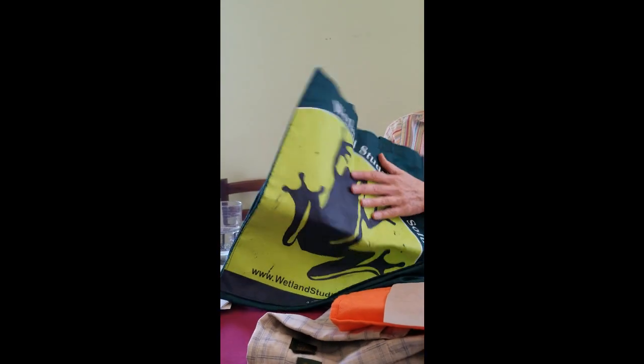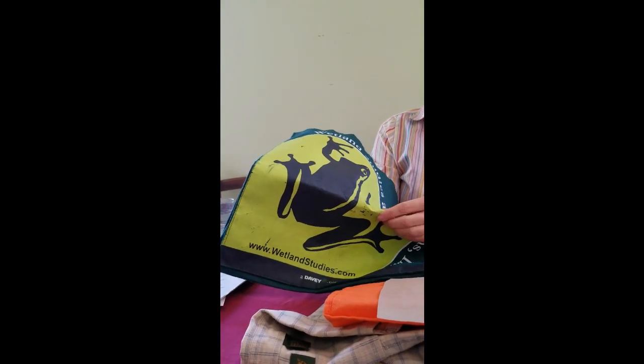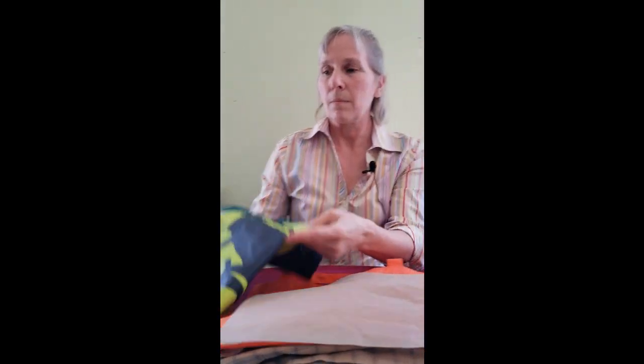So here's a 10-inch square of polypropylene. And if you had a decent bag, if you have a bag like this that's all plastic coated, that's really not going to do you much good because you're not going to be able to breathe through that. So you want either a plain bag, plain square of polypropylene, and if you live near me in Swissvale North, I'll be happy to get you a 10-inch square.